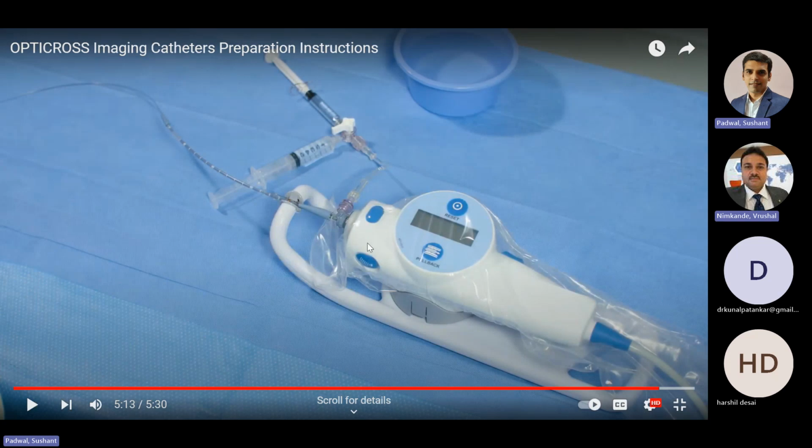Many Japanese operators, after doing the first pullback automatically, then the second time for whatever analysis they want to do, they just keep the imaging on. They insert the IVUS catheter, the telescope, again inside, and they launch the transducer. The transducer is radio opaque.